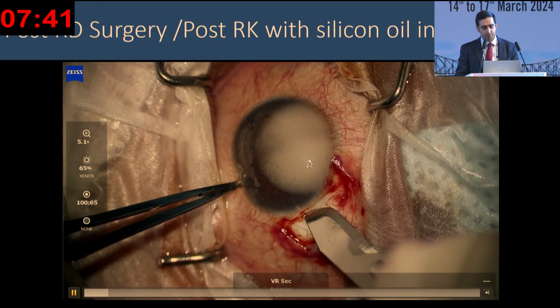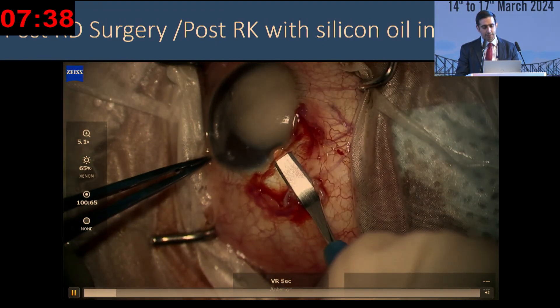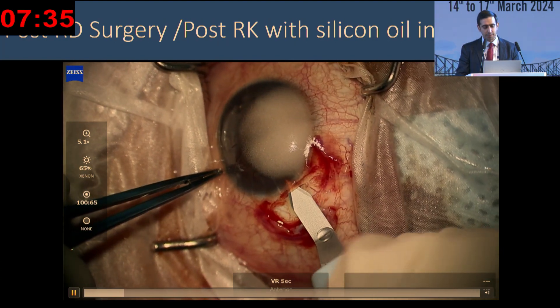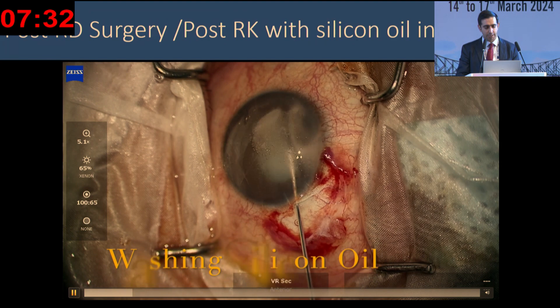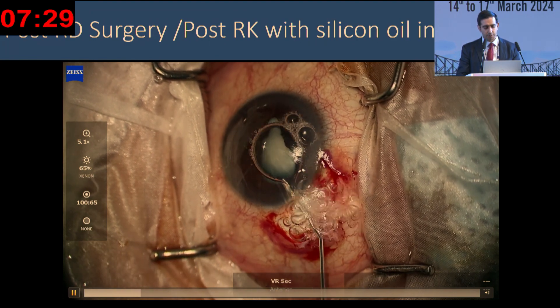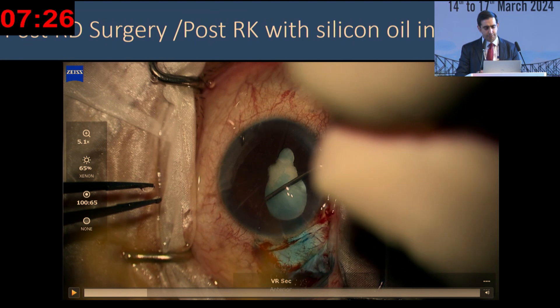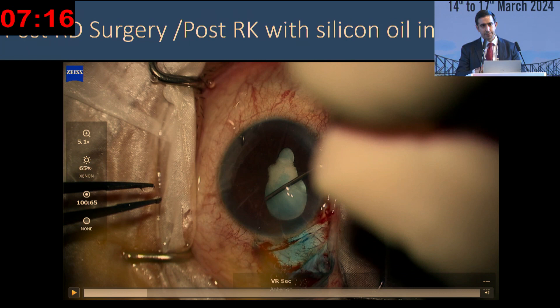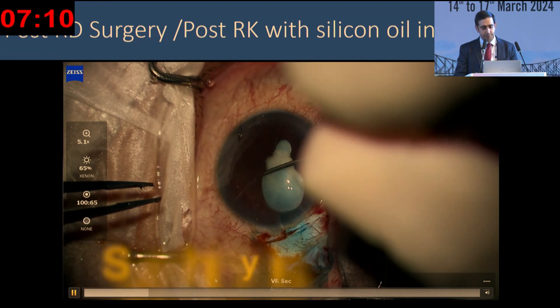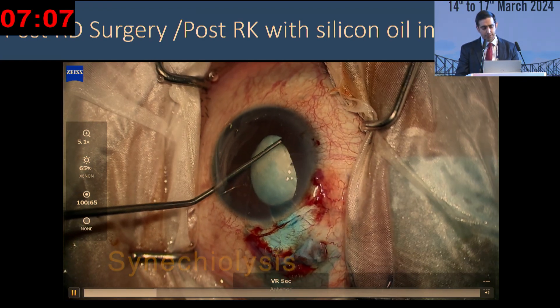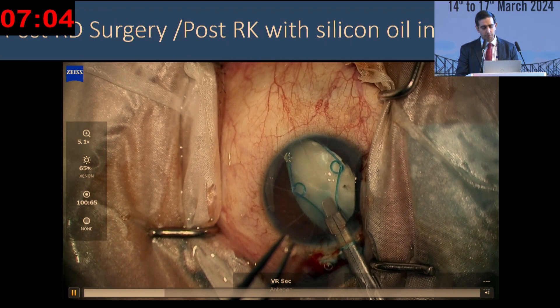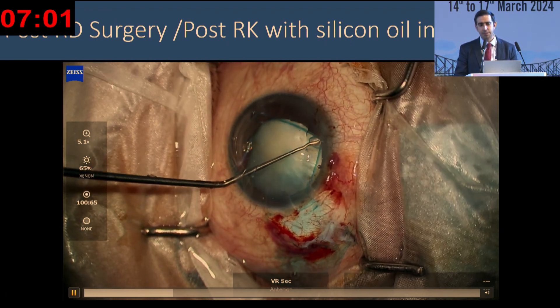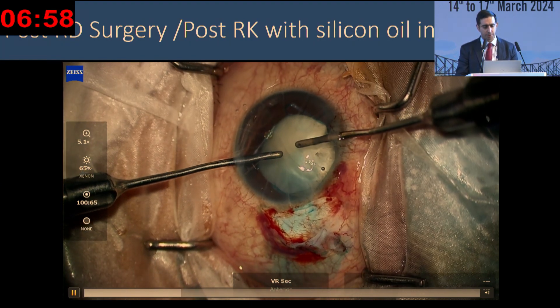In RK patients, I generally prefer to make a peritomy and a slightly scleral incision. You can see I'm making a three-plane incision and then going in with the keratome to open that. The first thing is to wash the silicon oil out. The other challenge is that this is a mature cataract with synechiae and a non-dilating pupil. When you stain with silicon oil, it tends to be a very slippery material, so the staining of the anterior lens capsule was not very good. Following this, we proceeded to do a synechiae lysis to improve the pupillary dilation. Because this was a very complicated case, I used a Malyugin ring to ensure enough dilation.